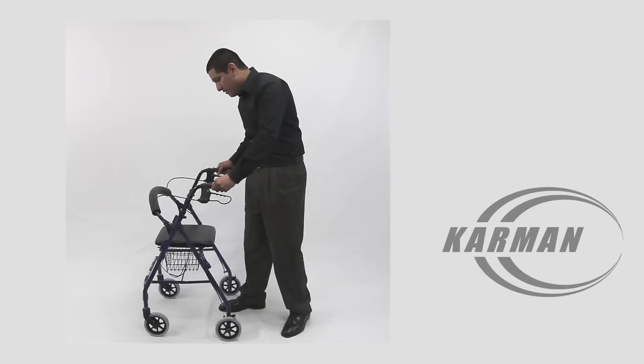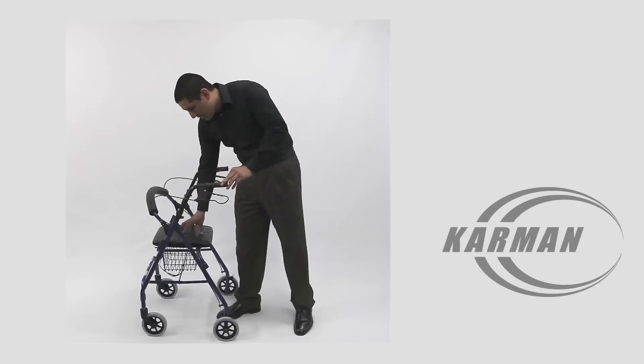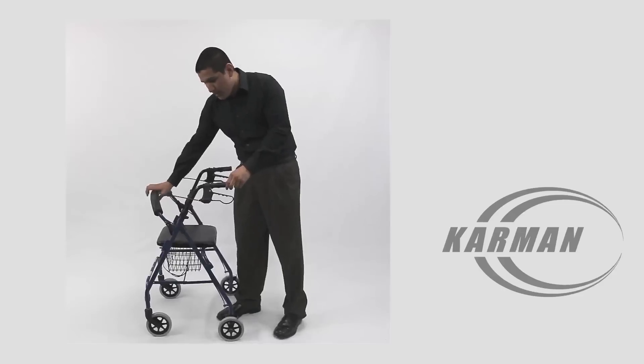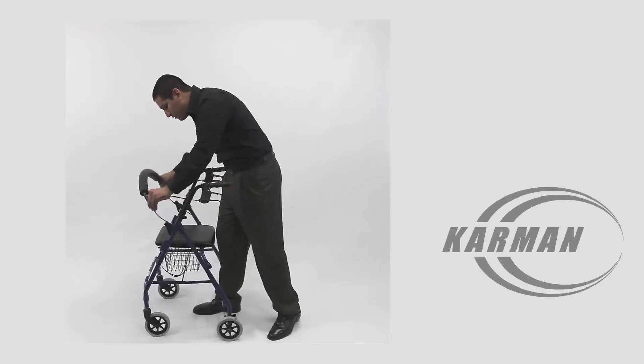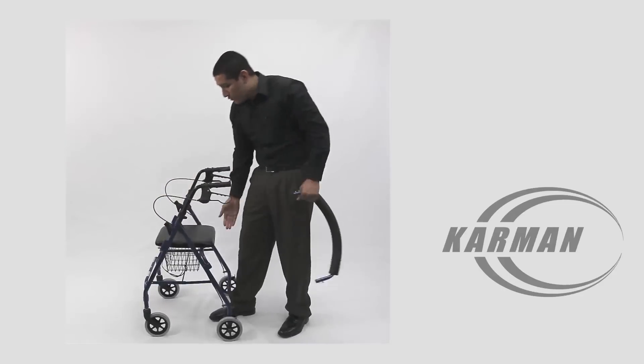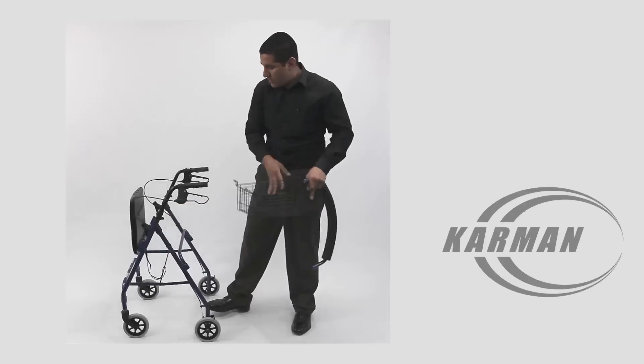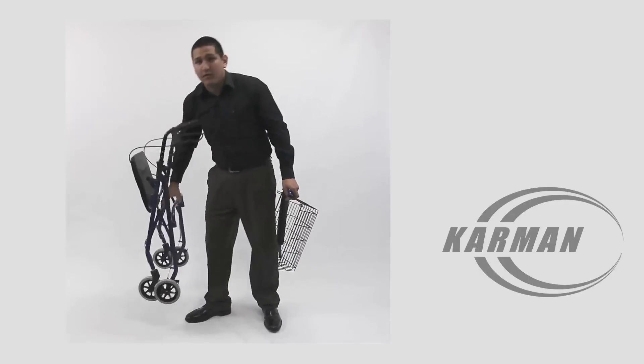This rollator comes standard with a durable vinyl padded seat as well as a padded backrest. Everything is easily removable as you see here on the rollator. You can fold up the seat, fold up the backrest, and you just fold up the rollator and you're good to go.